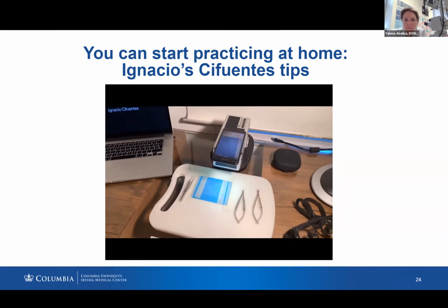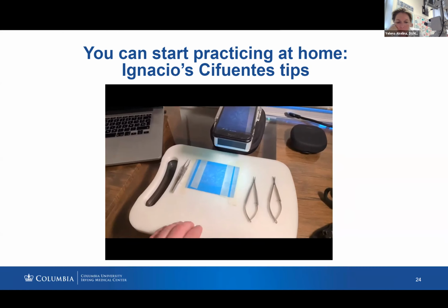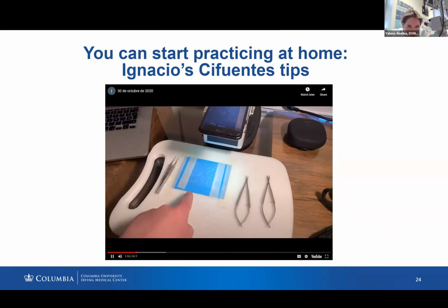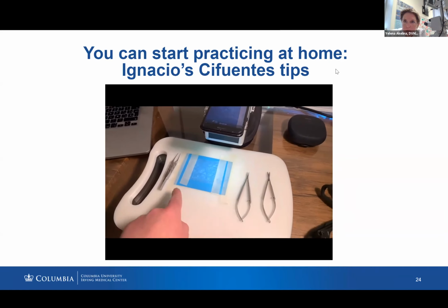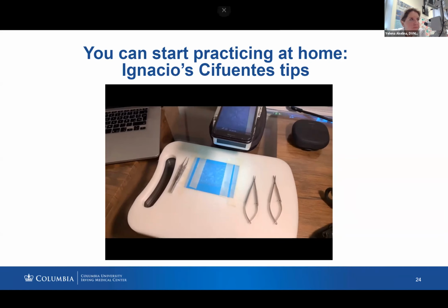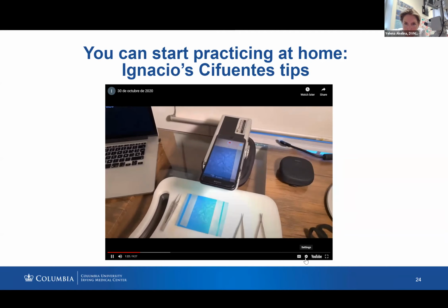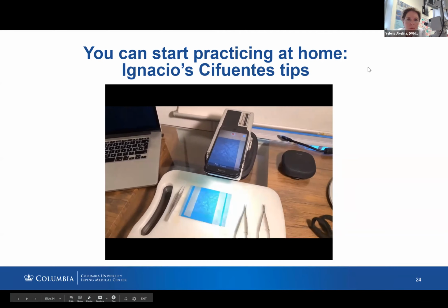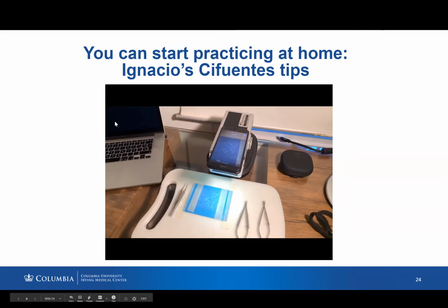So here are some tips. I use a board. I hold a color background below the plastic bag using tape. And for recording, you can have many options. I use this smartphone. I think it's easier to record my session so I can share it.